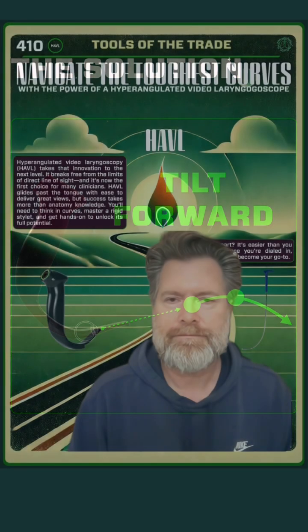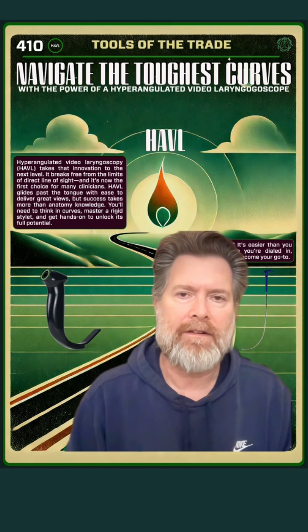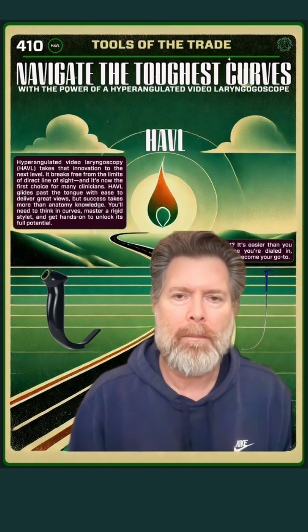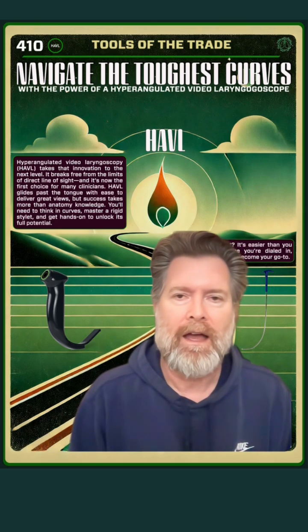It's really all about alignment with the tracheal axis. Once you get that great view, you need to understand that where you place the blade is going to have a huge impact on tube delivery. If you want more on this topic, go to our website, theprotectedairway.com, and find the poster that's behind me here — you'll be able to dive into even more great content about hyper-angulated video laryngoscopes.